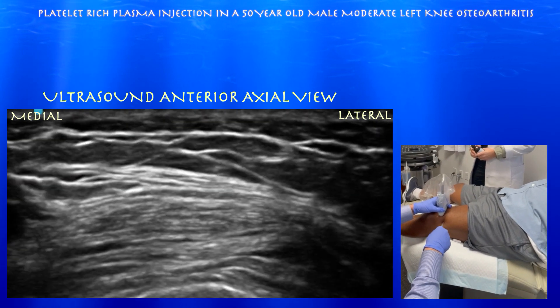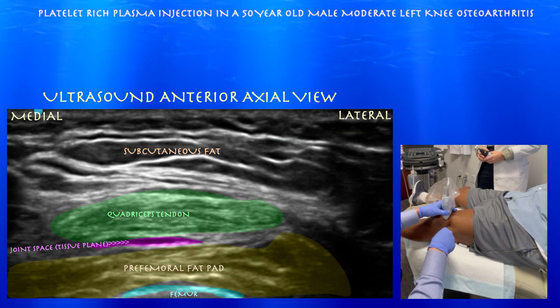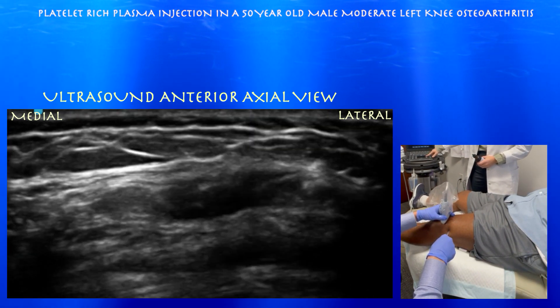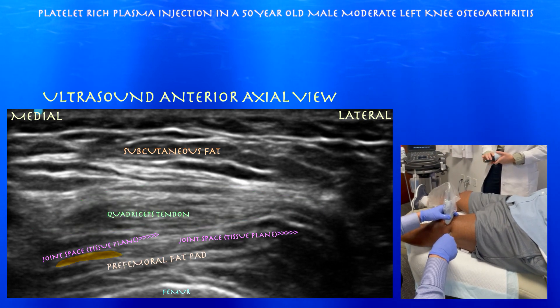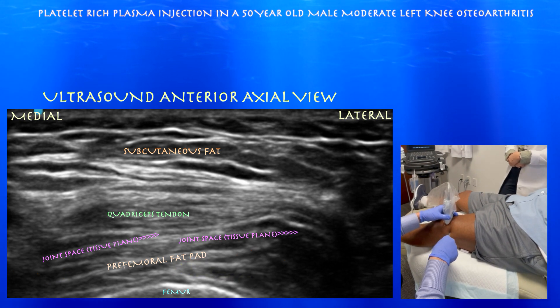Here's our first clip — right side is lateral. We can see that pretty thick pre-femoral fat pad, just gliding underneath the quad tendon. The knee doesn't really have an effusion. There are a lot of little dark lines within the pre-femoral fat pad, so sometimes you can get fooled as to what is actually joint space versus what is just within the fat pad itself.